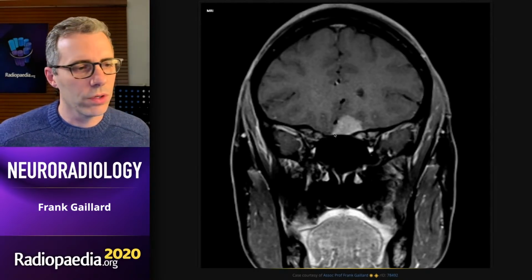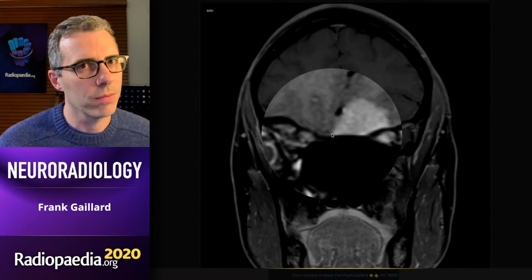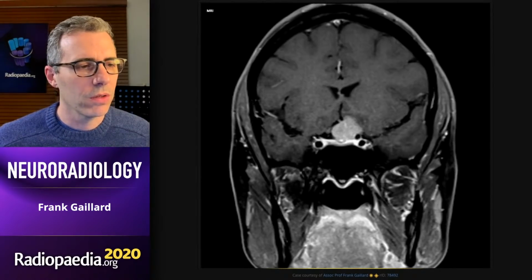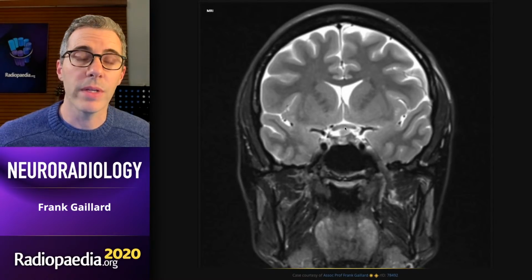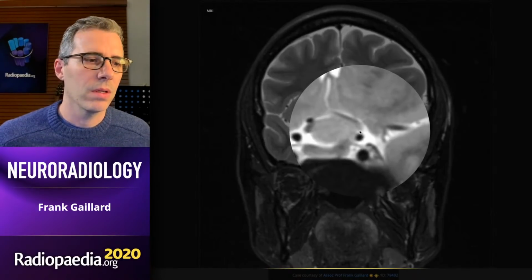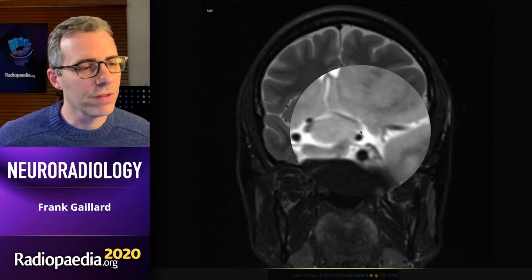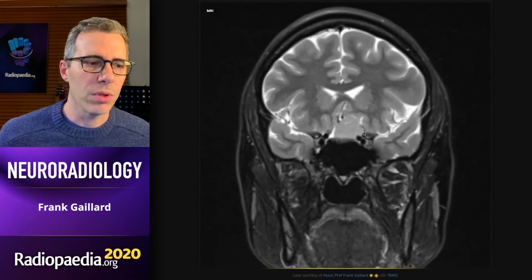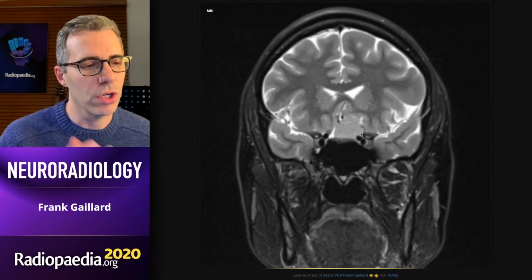And if we go to coronal, you can see a nice little dural tail, which is not pathognomonic for meningioma, but highly suggestive in this setting particularly. So there we go. And if we look posteriorly at the chiasm, we can see that the chiasm is a little bit elevated at this level. And as we come forward, immediately the left-sided prechiasmatic optic nerve becomes high on T2. And so there we go. Cause of blurring of the vision: a planum sphenoidale or tuberculum sellae meningioma.